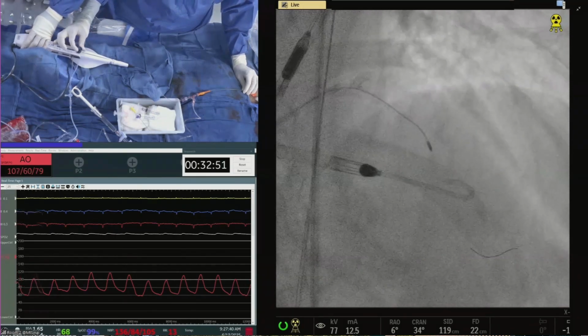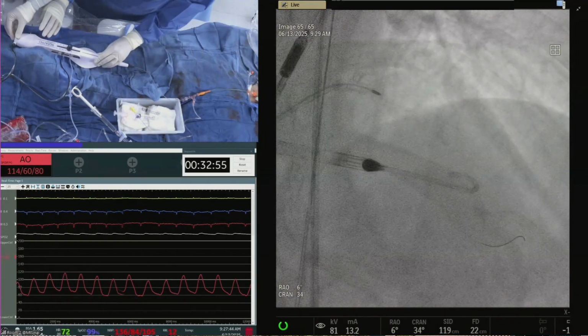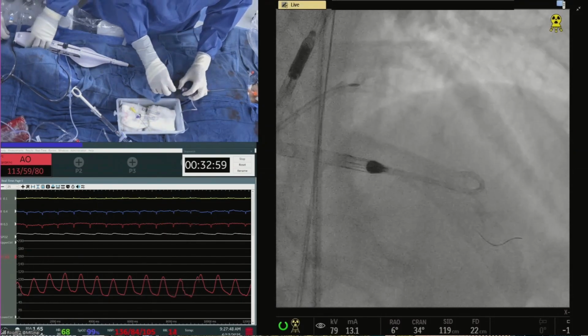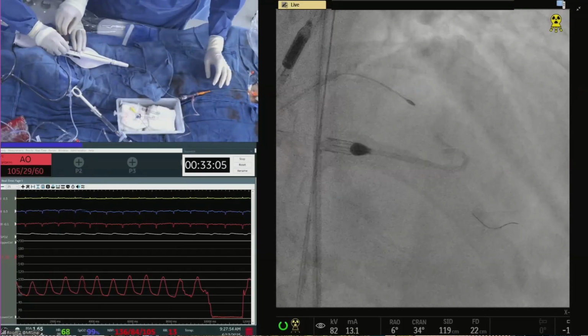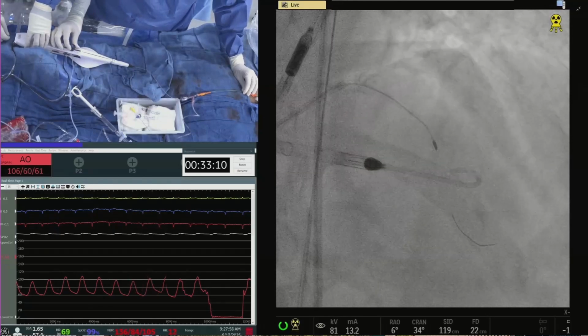Davide Capodanno, I haven't heard from you. What are your thoughts? Dr. Kinney is very cautious about that distal lesion in that second diagonal, and I'd be cautious too. One of the considerations we will make is I don't want to feel obligated to go very distal. I think you just want to clear a path to make sure you can enter the LAD, and I wouldn't necessarily go much further.